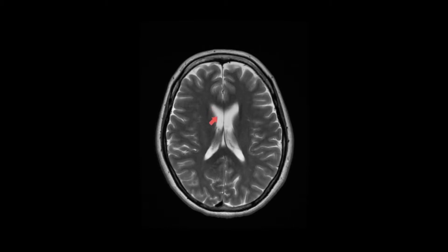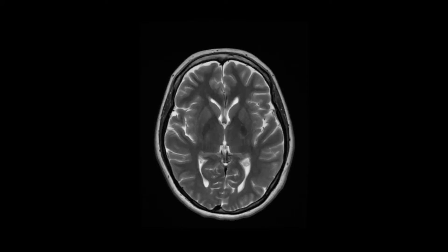This here is the right lateral ventricle and here is the left lateral ventricle. The lateral ventricles have certain defining features, namely a frontal horn that projects towards the frontal lobe. If we come down a couple of slices, you can see here is the right frontal horn of the right lateral ventricle and the left frontal horn of the left lateral ventricle.